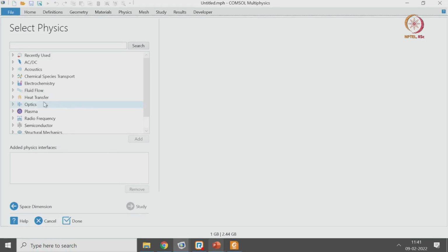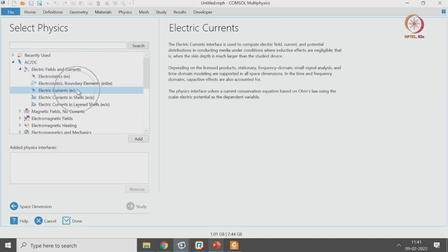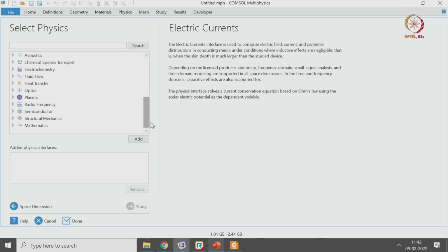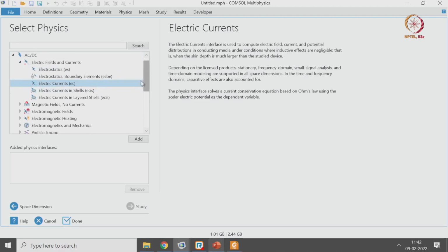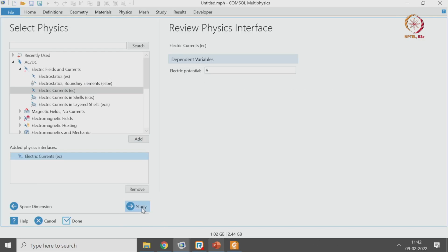This requires only the AC/DC module: if you go into Electric Fields and Currents, there is an option known as the Electric Currents interface. This is the only interface that is required in this case. Having said that, there are also other physics that you may be interested in at a later point, so I am just showing you all these modules. As of now, I will just go to Electric Currents, click on Add, and click on Study.